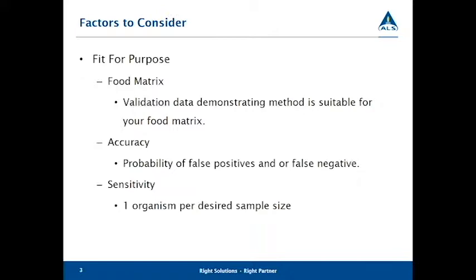And over the years, the sample size has increased. A lot of initial manufacturer validations are done on 25-gram samples, but we find ourselves now testing samples anywhere from 100 to 375, upwards to maybe even 1,000-gram samples.